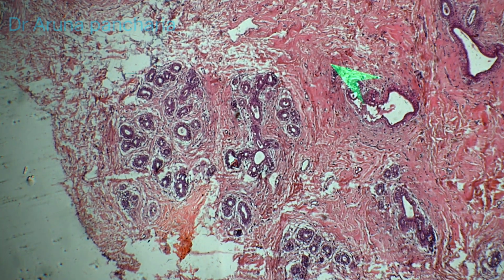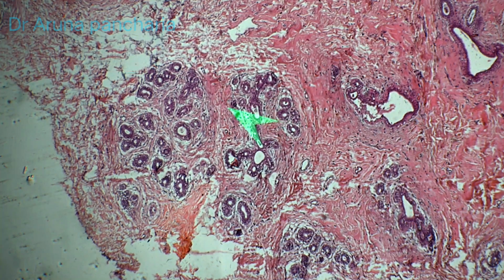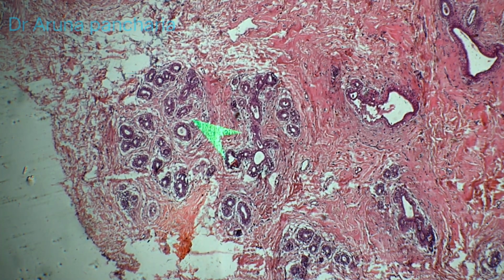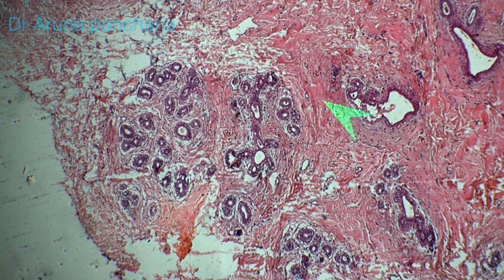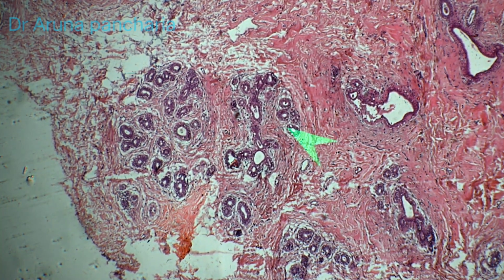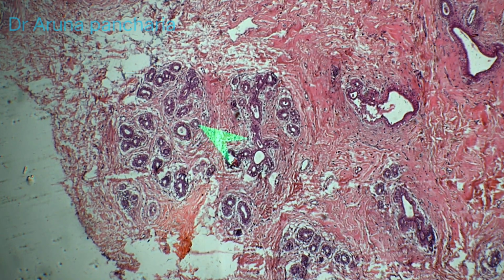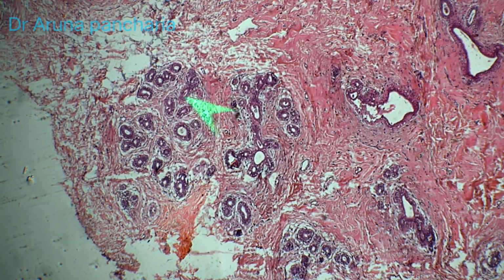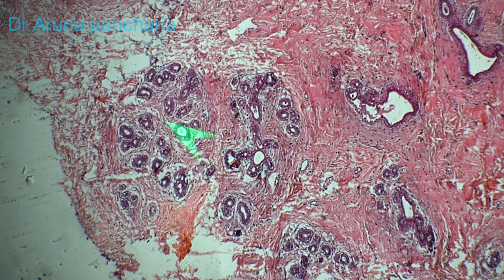Before moving on to the fibroadenoma, for UG students, you have to identify that you have received the slide of the breast tissue. So breast tissue is composed of basically 2 tissues, the glandular part and the connective tissue part, or the stromal part. So this is one lobule of the breast, this is another lobule, this is one other lobule, and in this lobule you can see the acini. All these are the acini, and acini are nothing but the blind ends of the terminal ducts.